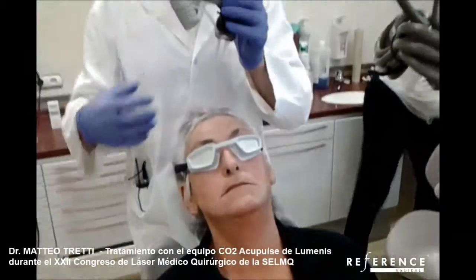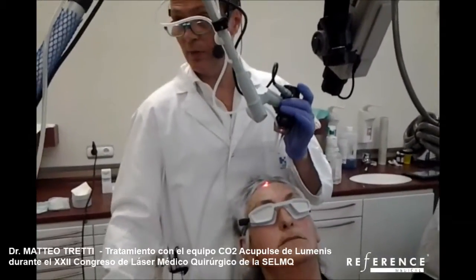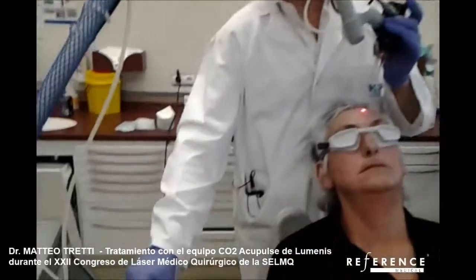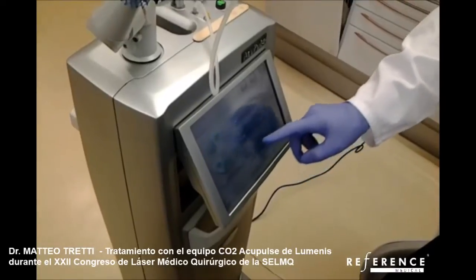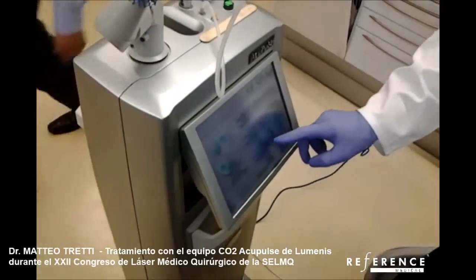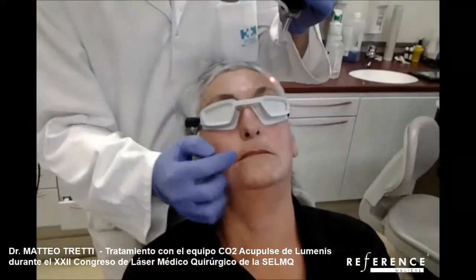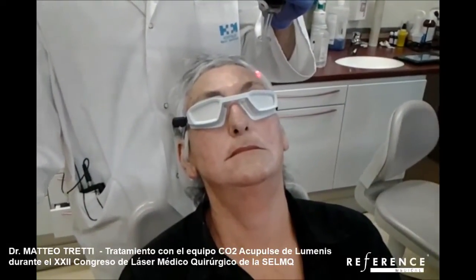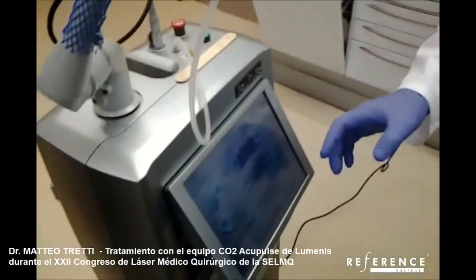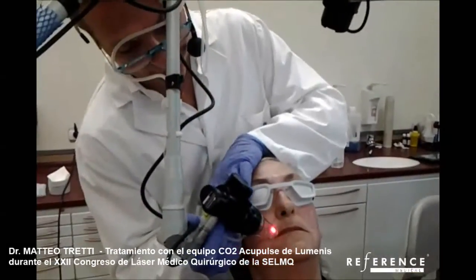Now I want to do an aggressive treatment so I move to combo mode. Combo mode means we have deep treatments one after the other, and immediately after we have the superficial treatments. In this area around the mouth, lower and upper lip and on the other side, I will use the combo mode.